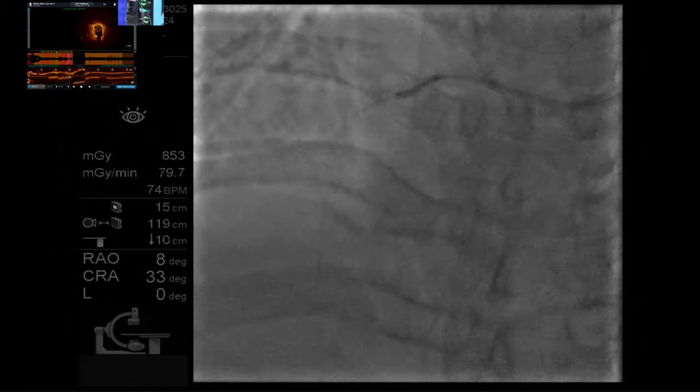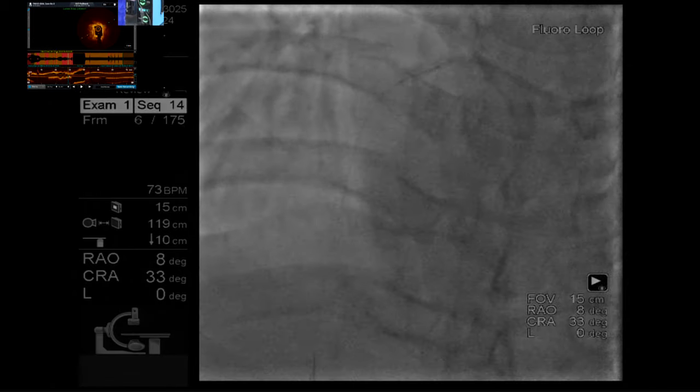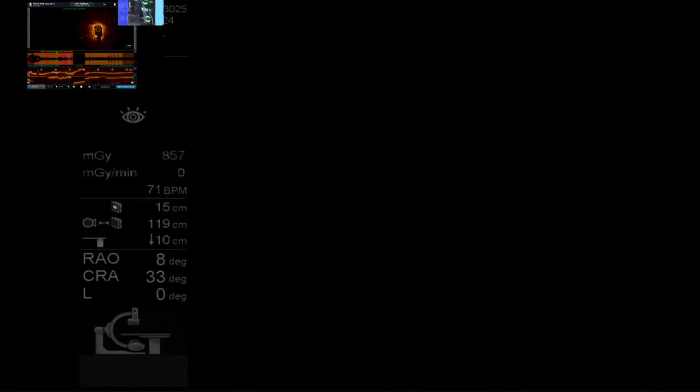Yes, that's right. And is it EEL to EEL diameter, one-to-one sizing? I tell you, many times with a lot of calcium, you are not able to judge. So I will go on the distal normal segment or proximal normal segment to decide my size. Wonderful. What do you think, Professor? That's the ideal way to decide the size of the balloon, right?